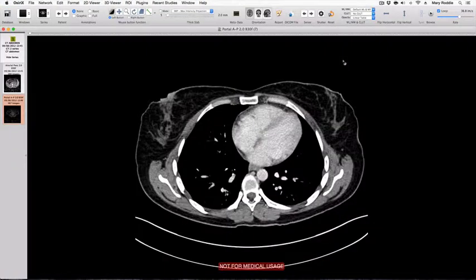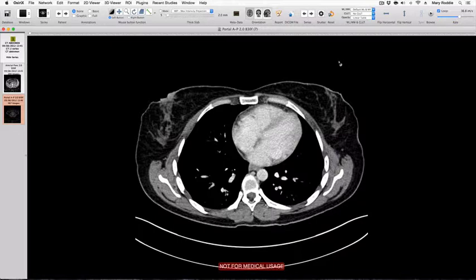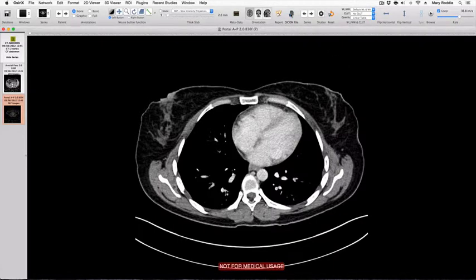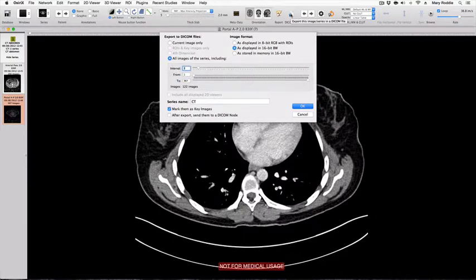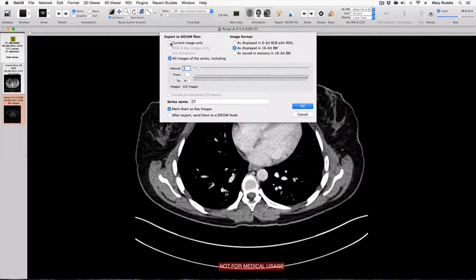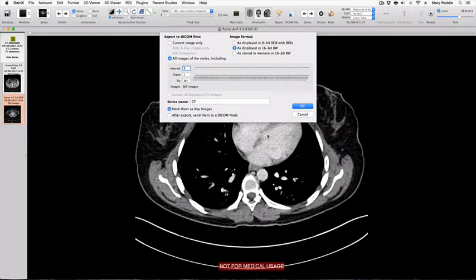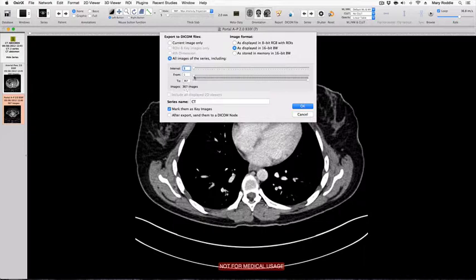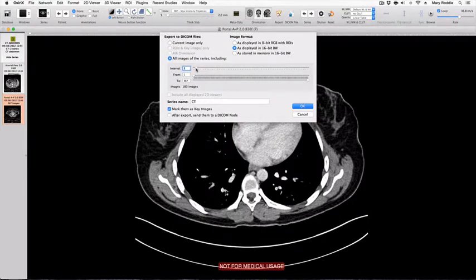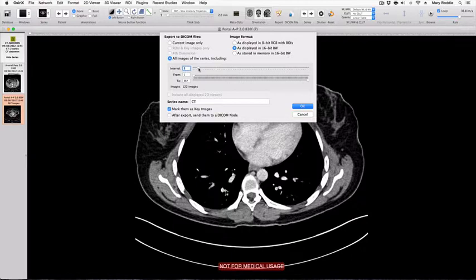The first way to reduce the number of images in a series is to export it as a new DICOM series. We do that by pressing the Export to DICOM button and this time rather than selecting Current Image Only, select All images of series including. If we keep the interval at 1 we will export all 367 images and the series will not have reduced in size. If we export every second image the series number reduces to 183, and if we export every third image the series size comes down to 122 images.